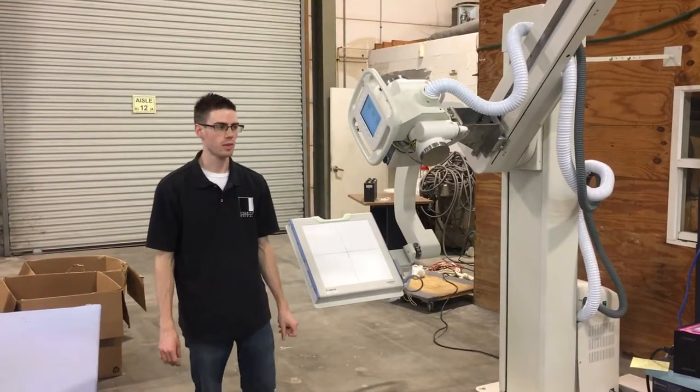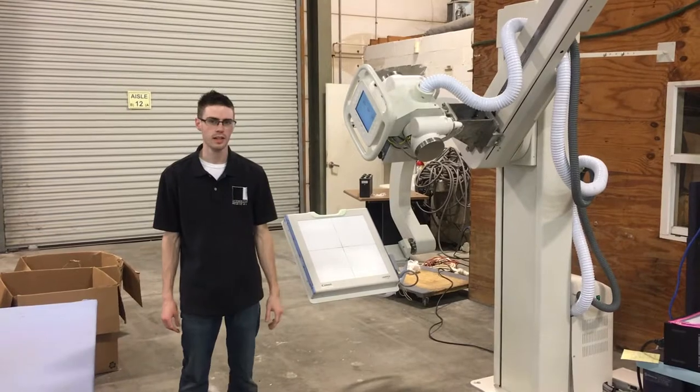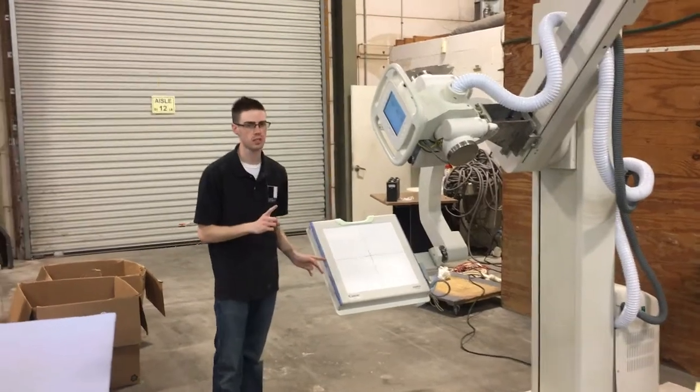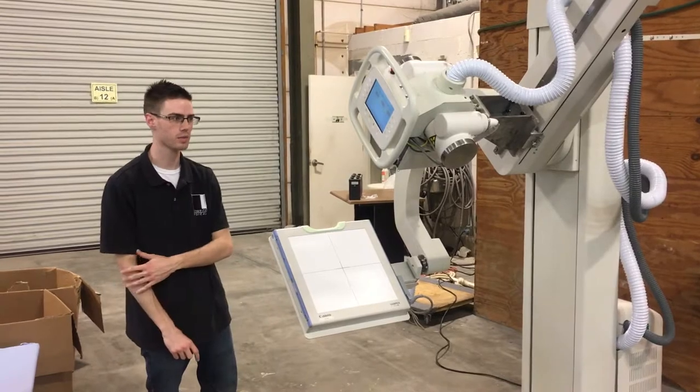Today we are going to show you the many different positions you can have with the PAXS U-Arm. Right now we have the U-Arm in the angulation position. This is a good position for if you're doing shots for the skull, for the knees, or for the elbows.